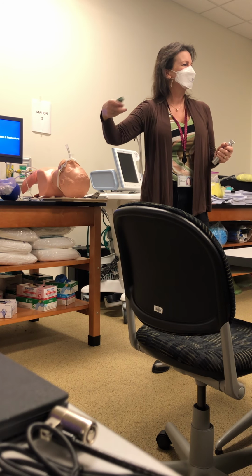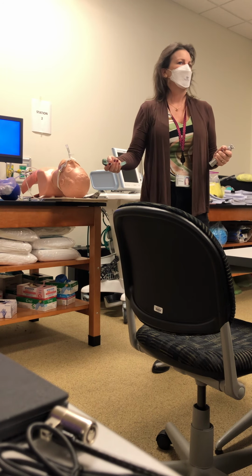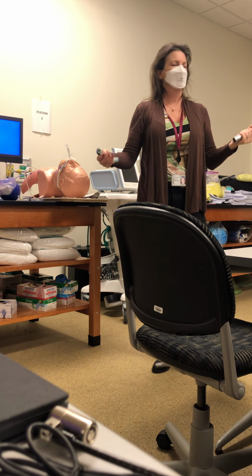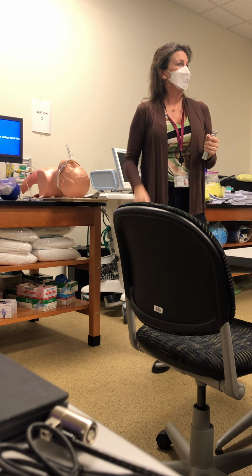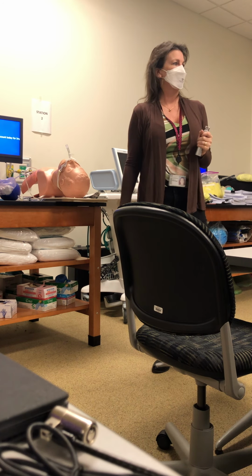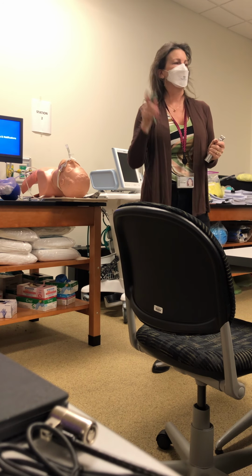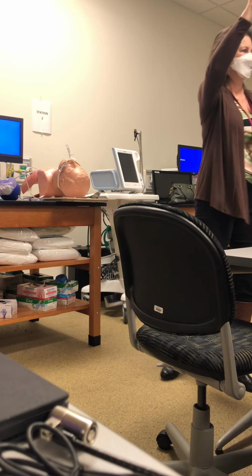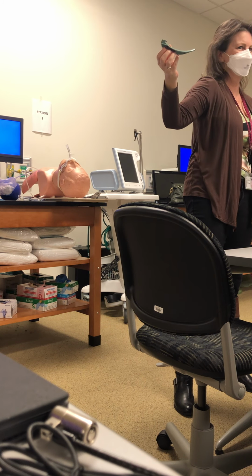So it depends lots of times on the physician's preference if they're intubating. So like one of our intensivists, he likes a 4 Miller, and I know that. So if he was intubating, I would go get a 4 Miller. If my other intensivist was intubating, I would go get a 3 Macintosh. So it depends on their comfort level, what they feel more comfortable intubating with.